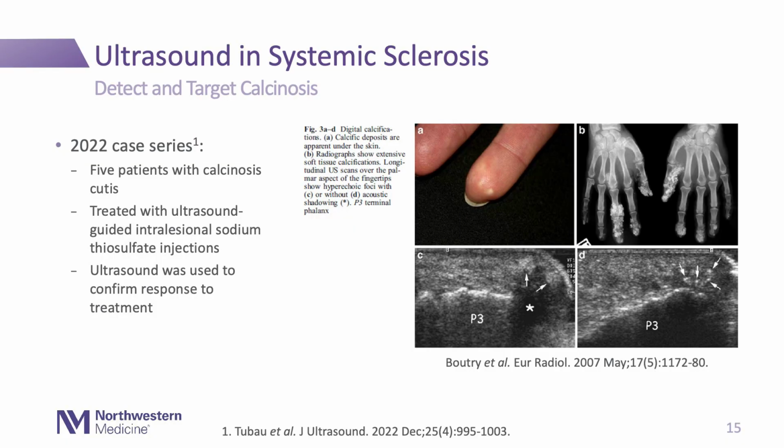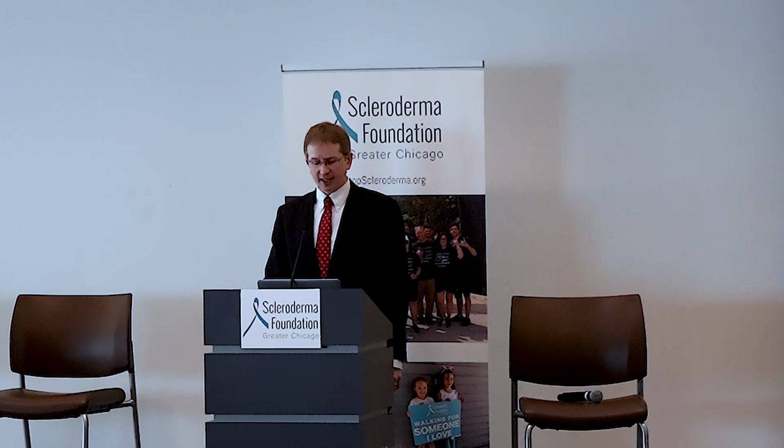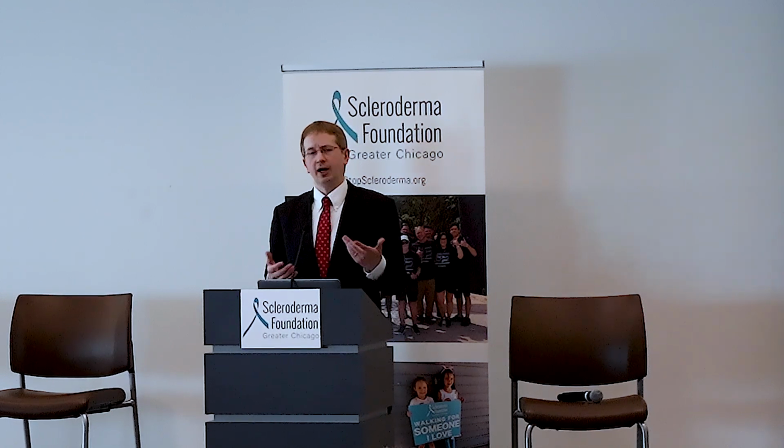And then the last major content slide here is basically calcinosis. Like Dr. Richardson was saying, sometimes the calcinosis is right there. It's in front of you. It's right on the surface. You can feel it. Sometimes it's quite overt on the x-ray, but sometimes it's actually quite subtle. Or you've got a lump in one or two places and you don't really know what it is, and maybe it's a little bit deeper. You can't see it. And so that's a case where, yes, you get an x-ray, that's fine.